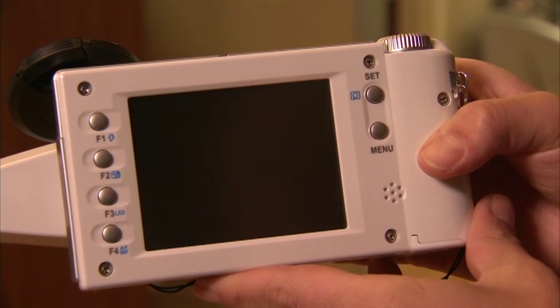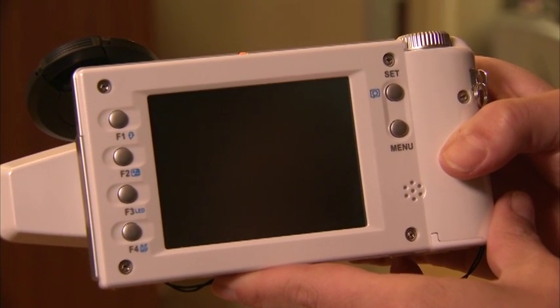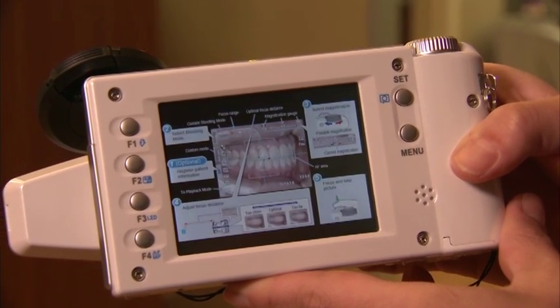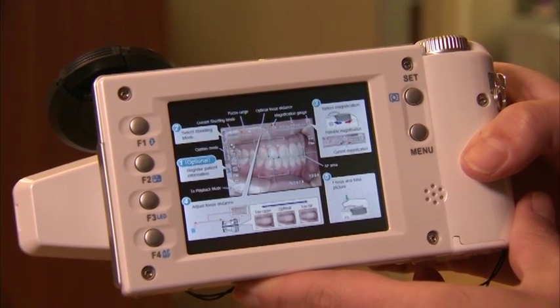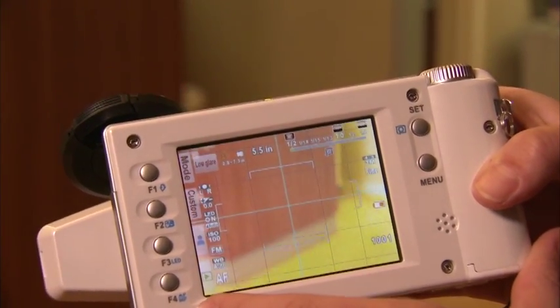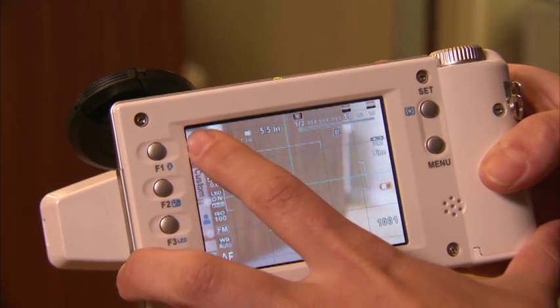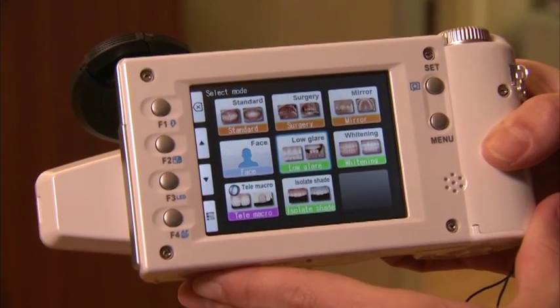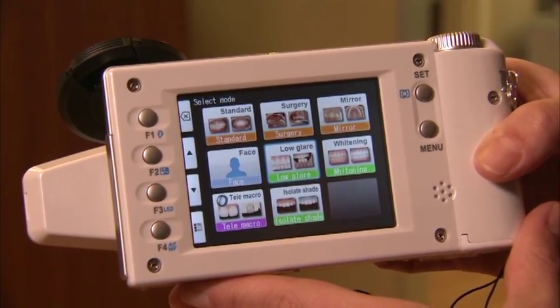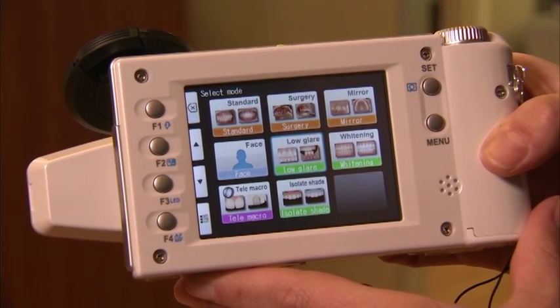One of the interesting features of this camera specific to dental is its ability to take a really accurate shade. We have two basic mode options to select. Going to the mode option and looking closely at the back of the screen, we see a low glare button as well as an isolate shade button.